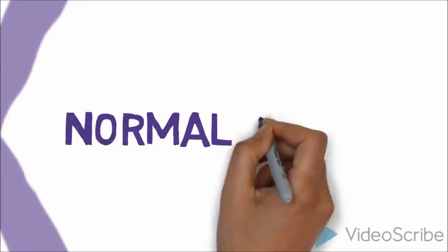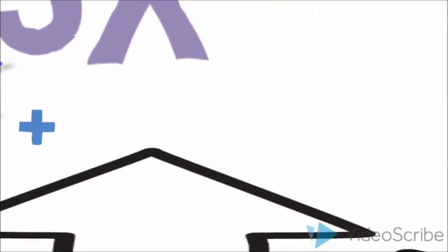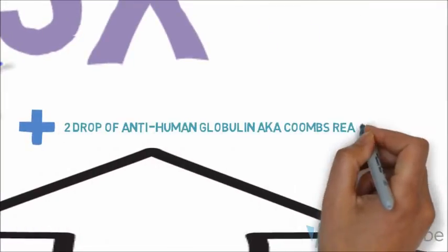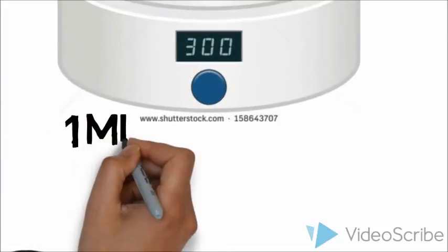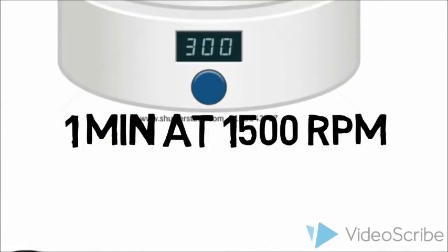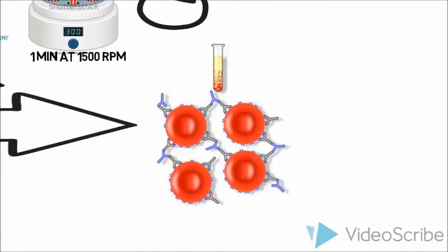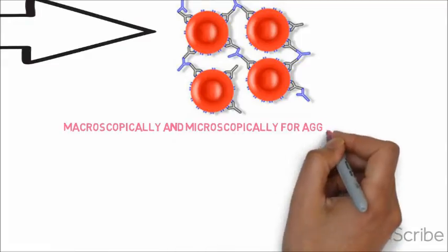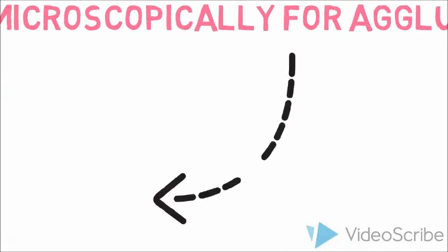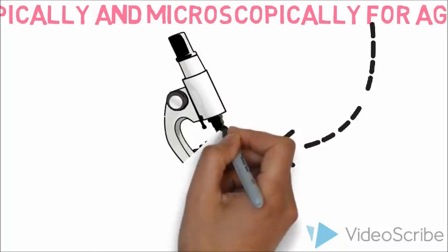Then we add 2 drops of Coombs reagent and centrifuge at 1500 rpm for 1 minute. Then we resuspend the cells and examine the macroscopy as well as the microscopy. The positive test result includes RBC agglutination.